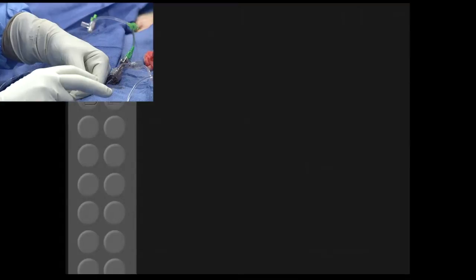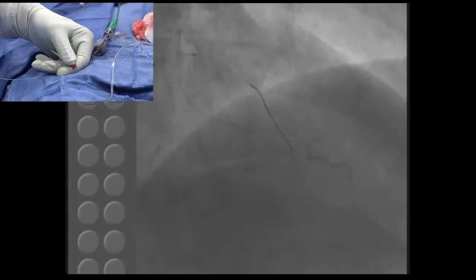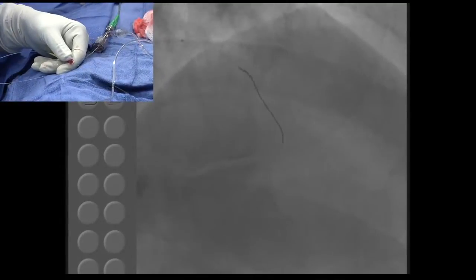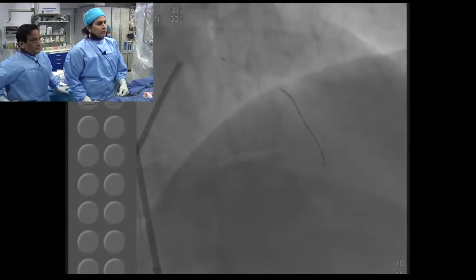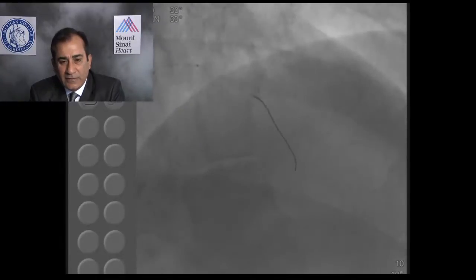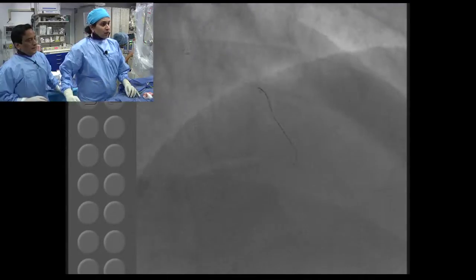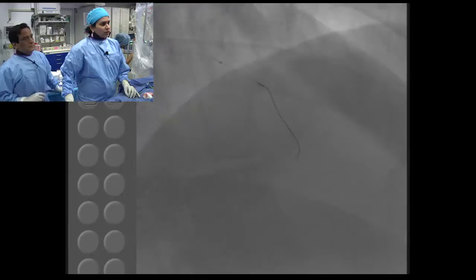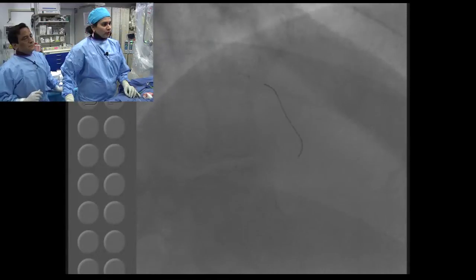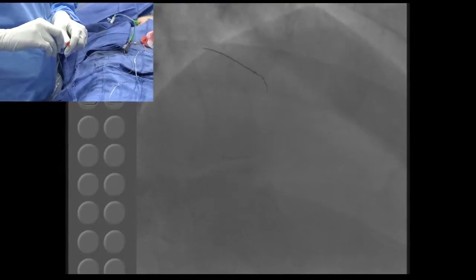Good. Low MAC. Go. Yeah, you definitely look to be entering the right channel, but probably in the septal. Anu, would it be absolutely crazy to consider ever, or I don't know what has been your experience, an epicardial approach? Ever done that? We have done two cases, but both were like I told you, no curly, straight cases where your chance is that you'll be able to go through rather than have rupture of the epicardial vessels.